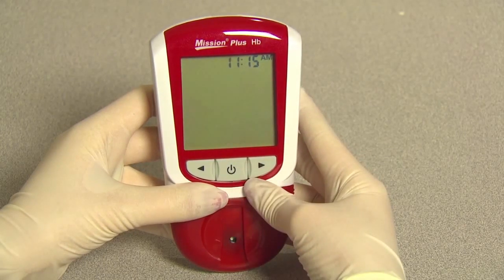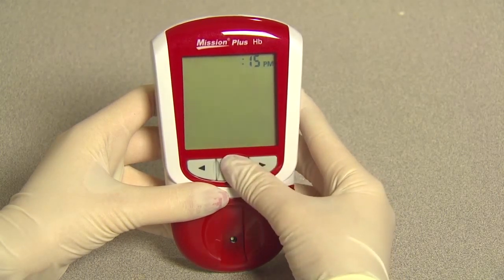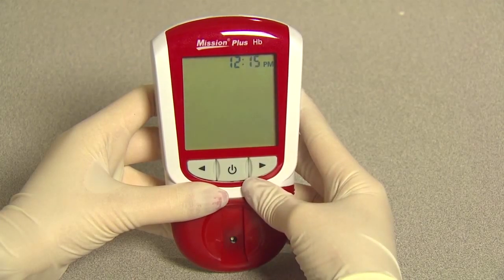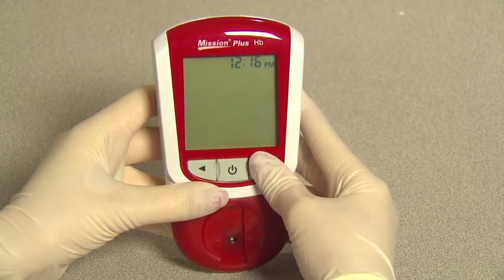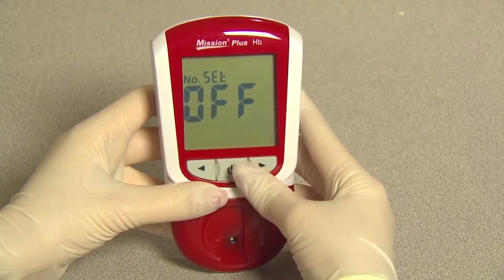The hour and minutes will appear at the top of the display. They will be separated by a colon with flashing hour. The meter will display AM or PM if the 12-hour time setting is chosen. Press right or left until the correct hour is displayed. Press the power button to save and proceed to minutes. Minutes will flash. Press right or left until the correct minutes are displayed. Press the power button to save and proceed to test number reset setup.